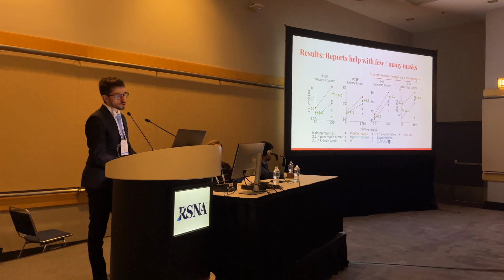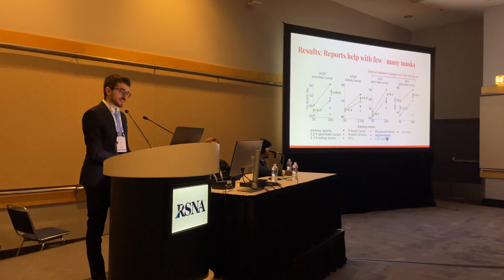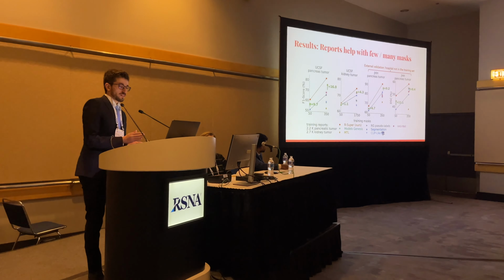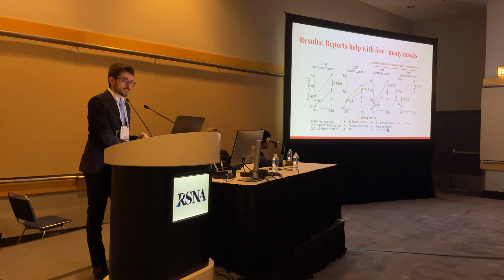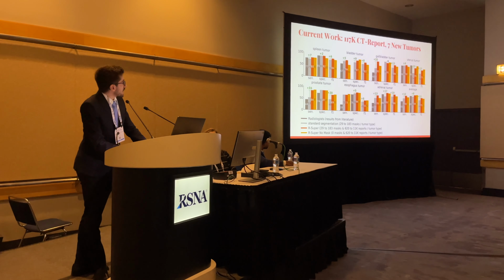Even with almost 2,000 kidney tumor masks, if you add 3,000 reports, you gain 4% F1 score. So no matter if you have few or many masks, add reports to your data set and you can get a lot of performance. And this is our last result.